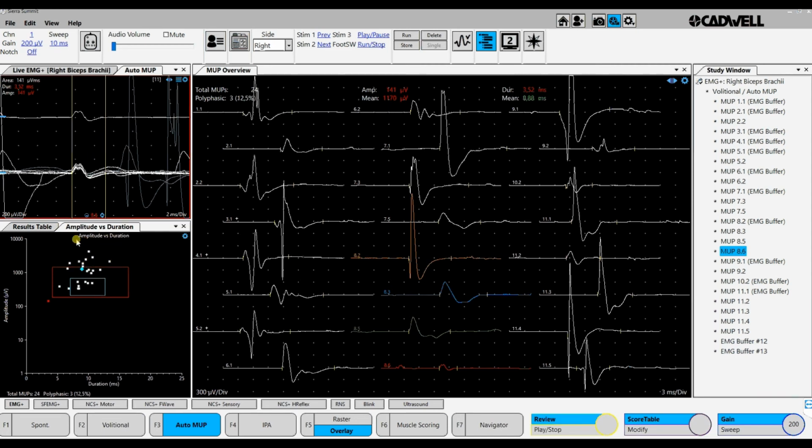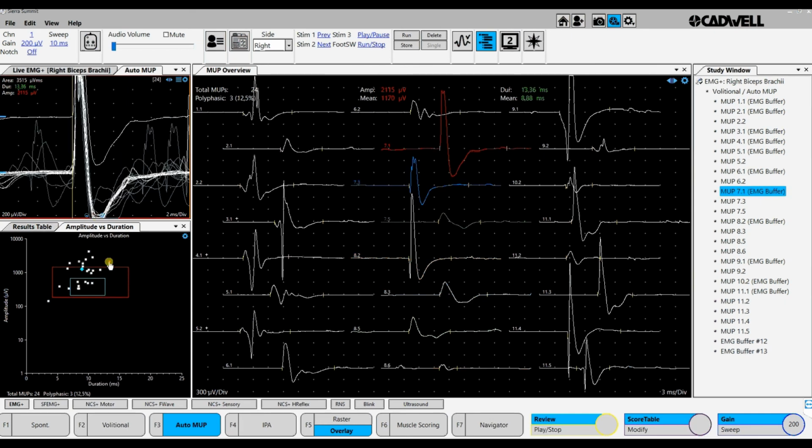So this is a slightly neurogenic situation, and we saw that also in the turns amplitude interference pattern analysis, that we got the neurogenic pattern. When I do the individual checking of the signals, I see them also displayed, all those that contribute to the averaged signal.